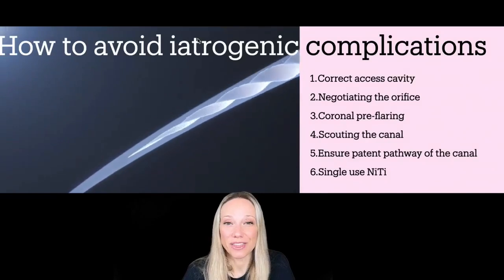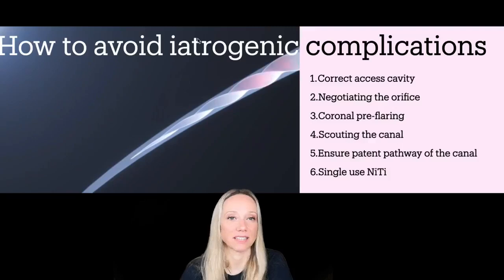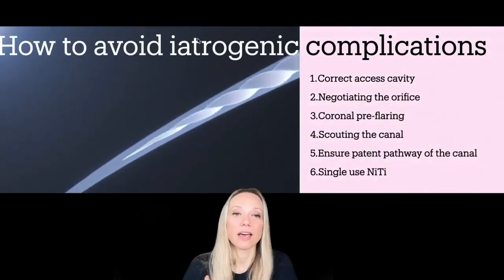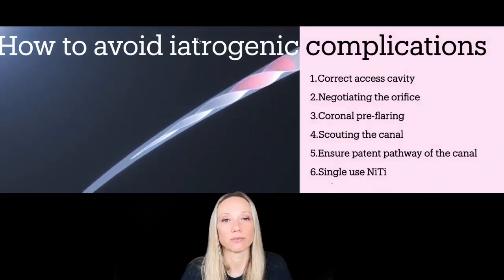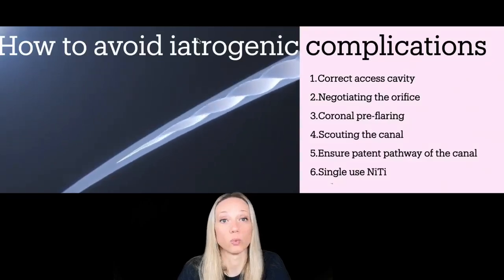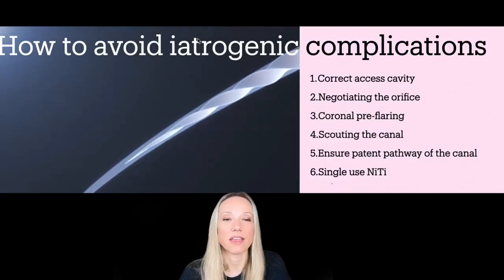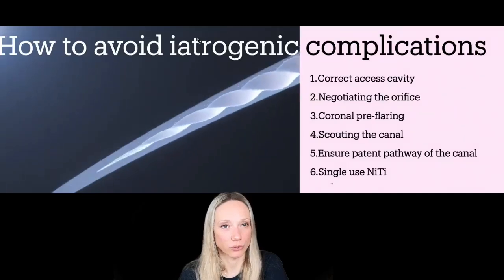And the first thing that we have to do to avoid breakage of files is to make a correct access cavity, because this is going to remove most of our problems that we encounter in the coronal third of the tooth. And then we have to negotiate the orifice a little bit, do some coronal preflaring. If we see that the file cannot proceed freely inside of the root canal, we have to preflare a little bit. And then we do the scouting, so we know what we're going to encounter, how the anatomy is going to be, and then we have to ensure the patency of the root canal that we are going to treat.